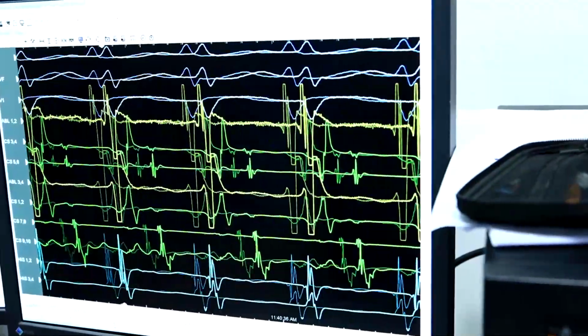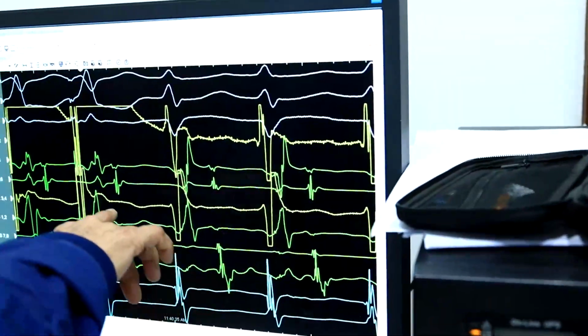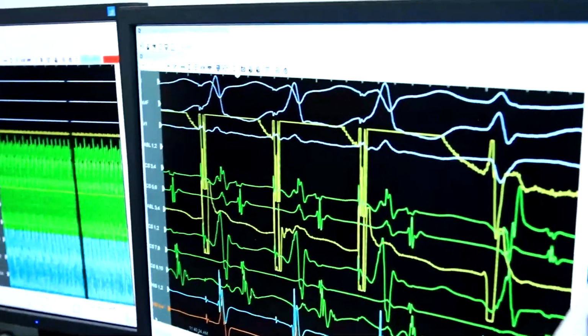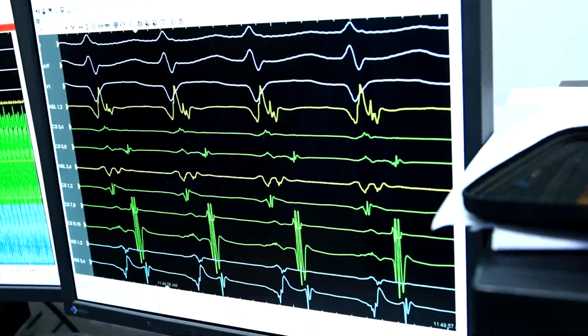And then this is the tachycardia running. Here we were pacing during the tachycardia from the left side. The tachycardia is running, and this is entrainment. And VAV response, that was the key, with well entrainment from the left ventricle.